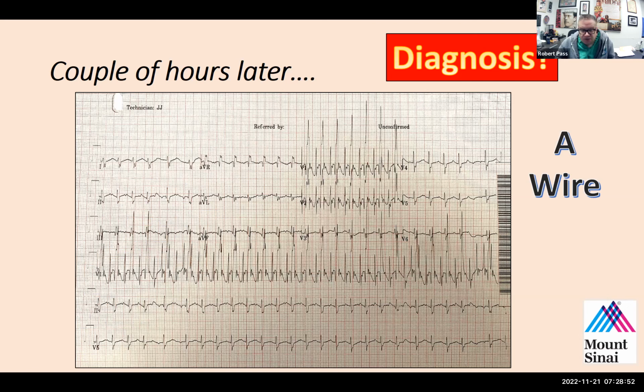Of course, because we always have an external defibrillator on the patient during this form of testing, during those 6 attempts, we attempted 3 times externally. And finally, on the very last shock, we were able to terminate the VF that we had induced. As you would imagine, it was quite dramatic, very unpleasant, a few minutes in the operating room. And then when we looked on fluoroscopy, we saw that the patient had a pneumothorax in the left chest.